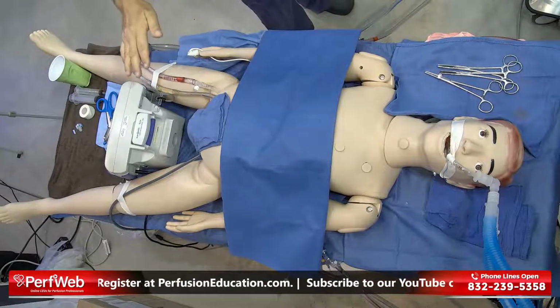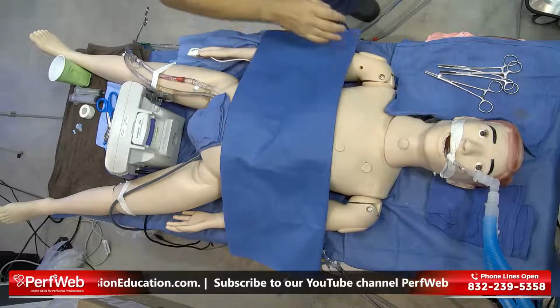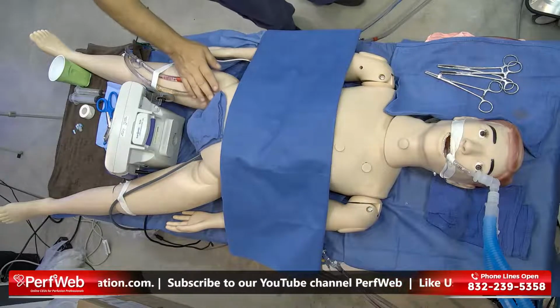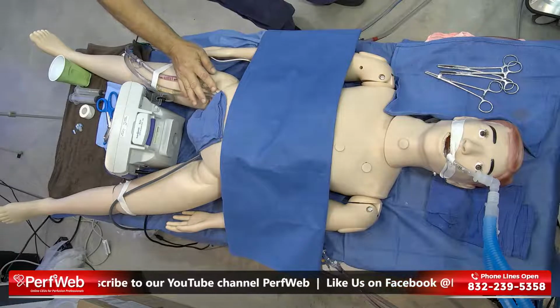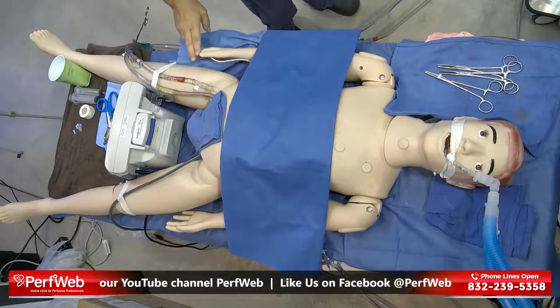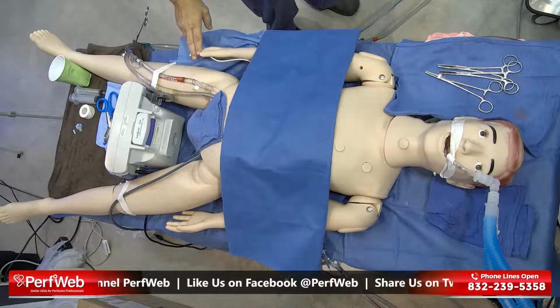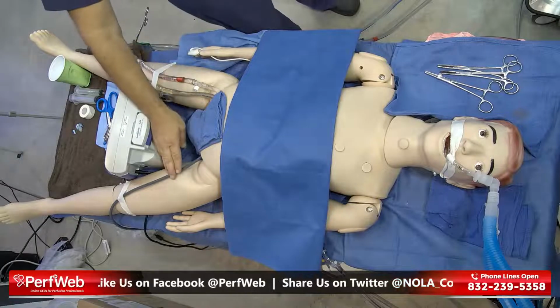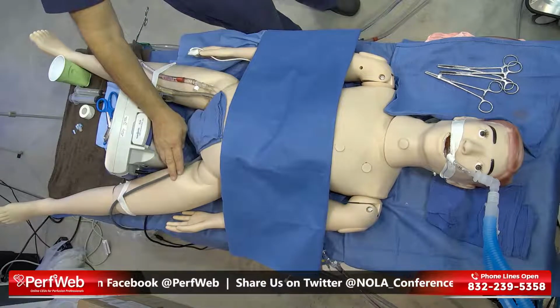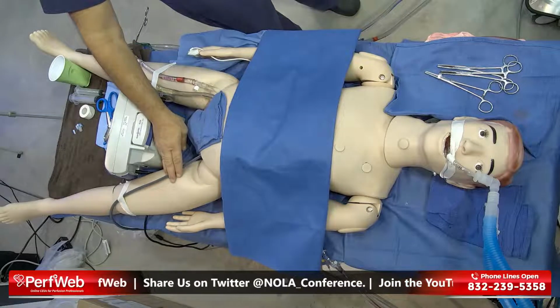So here's our patient here. And you can see that he's intubated. He's cannulated here in the femoral vein for access and femoral artery here. He has a pulse oximeter on his right hand, which is the correct place to have it in this particular case. He also has an Impella, an Impella CP, which is operating at 3.1 liters per minute.